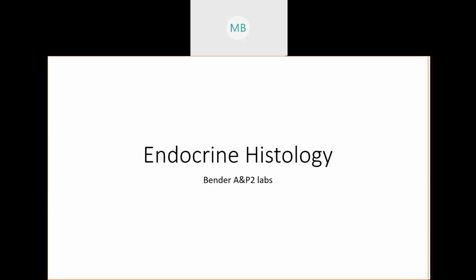This PowerPoint is to give you a rough idea of what to look for when you are taking your quizzes and looking at things, so you know what to look for and don't panic, essentially. So we're going down your lab list and we're going to go over the big concepts of what to look for to identify information.